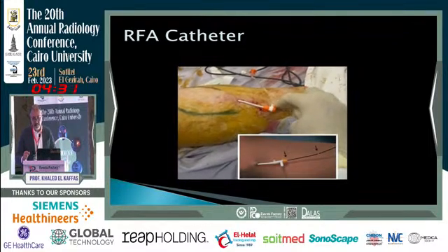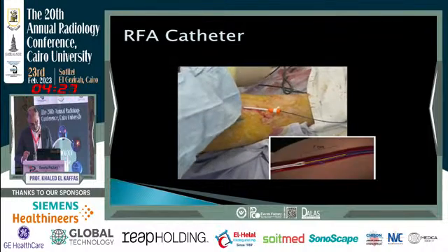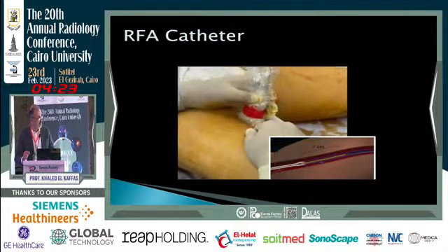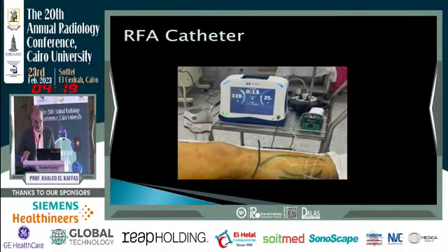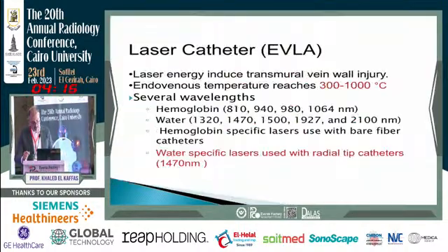We call it segmental ablation. We do excellent compression on the site of ablation to ensure total coaptation of the venous wall to the ablation catheter.